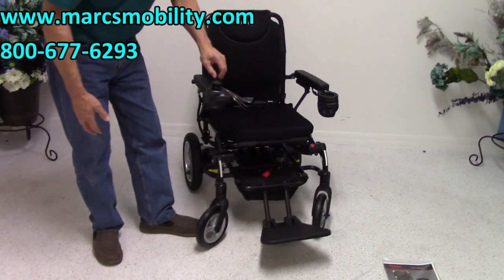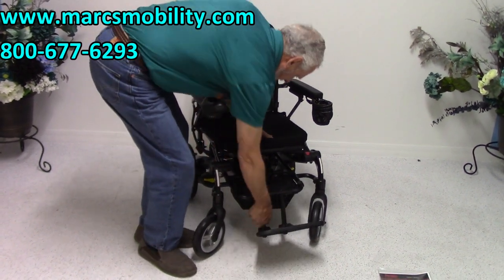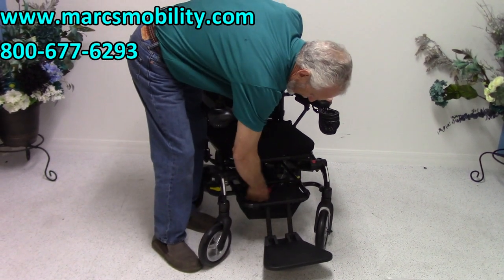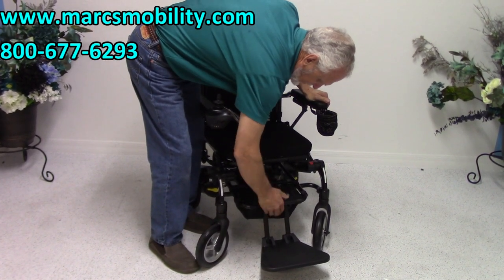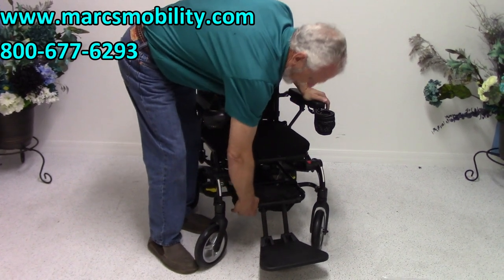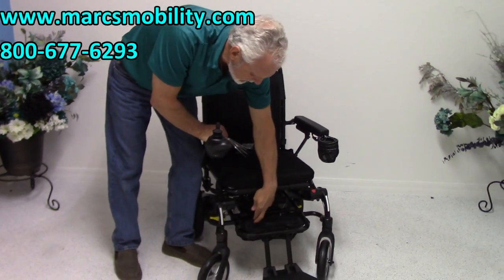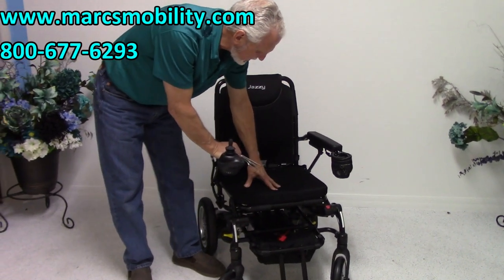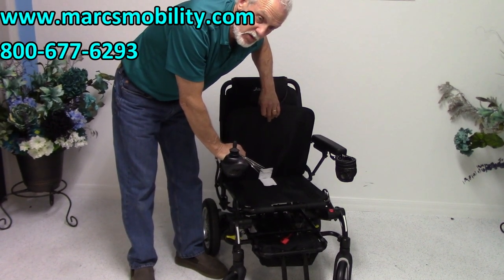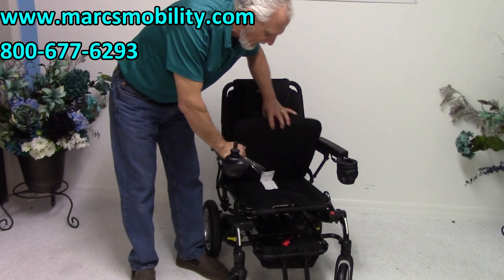In the front you have a foot plate that flips up. There's also a little basket down here — your charger is already in the box right here, which we'll use for the presentation. Your charger is included with the power chair. You also have a removable cushion; if you wanted to put your own cushion, that's now an option with this chair.